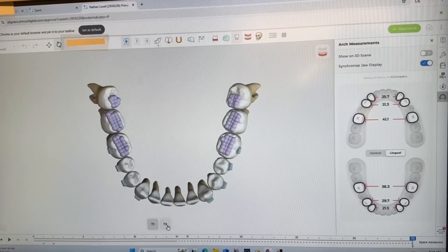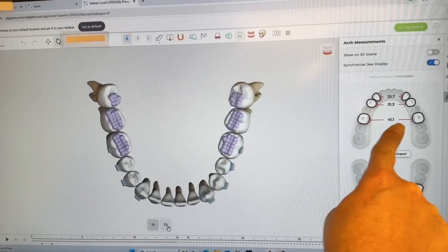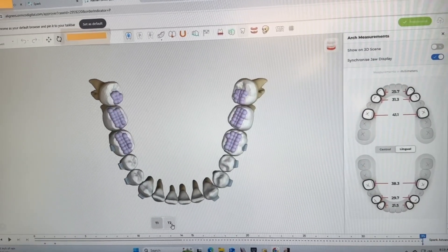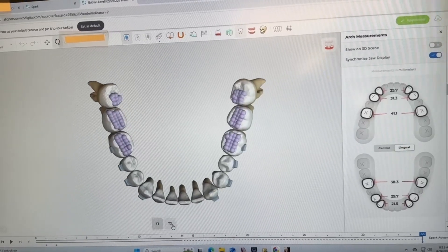Now we're going to take a look back at the top jaw. With this increase planned for the bottom, we can get his upper arch to about 41.1 millimeters, which is awesome.